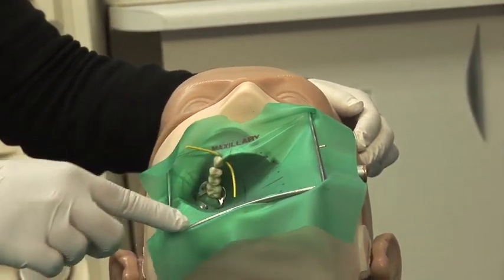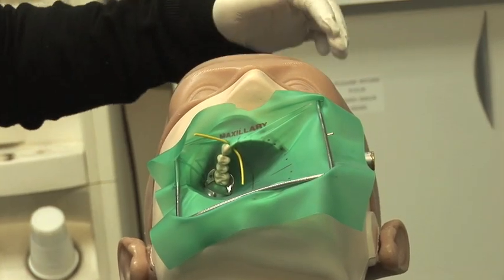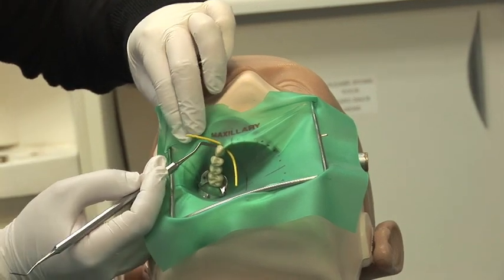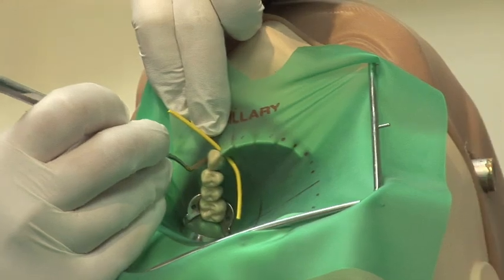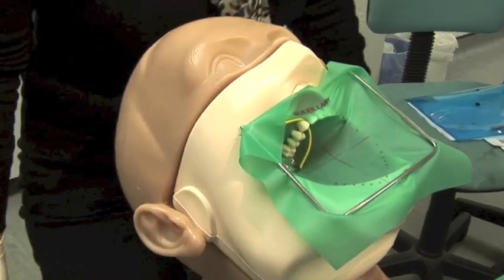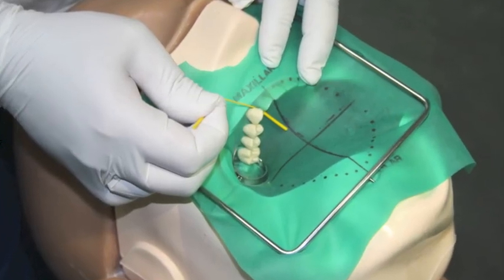The dam should be centralized over the mouth and the frame should lie over the chin. Now invert the margins around the teeth — using a flat plastic instrument, push the dam so that the edges are facing towards the gums.